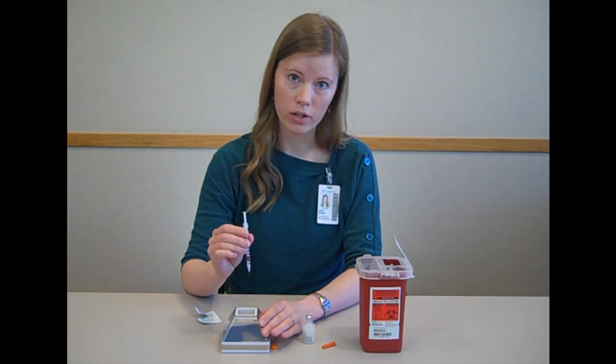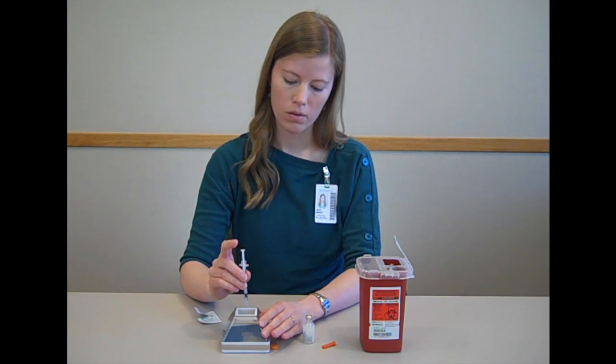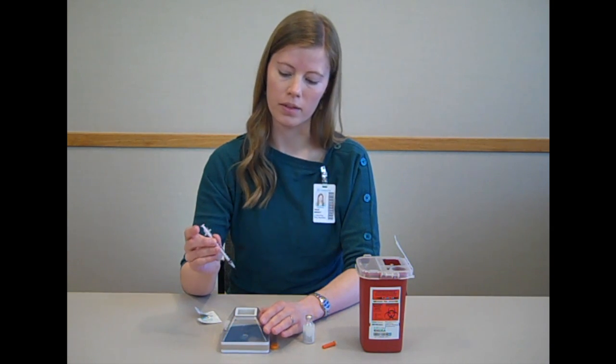When you're injecting, make sure you go in at a 90 degree angle to the skin. Put the needle in the skin and press down on the plunger until all of the insulin is injected. Then wait five seconds and withdraw the needle.